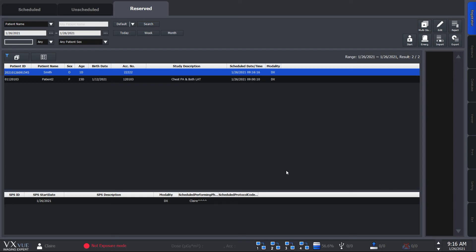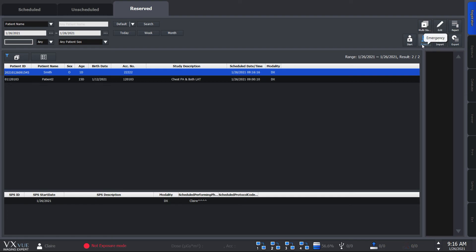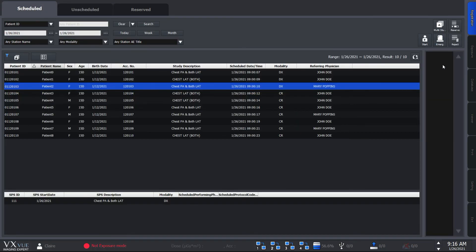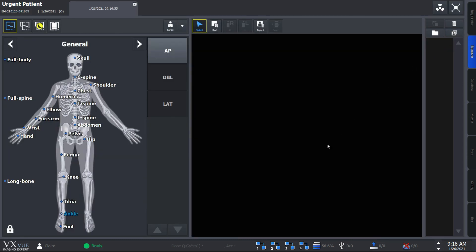Now you may have an emergency where you don't have the time to fill in all these information. And in that case, just hit the emergency button and it'll take you directly to exposure mode. We have the emergency button here under the reserve panel, here on the unscheduled panel, and here on the scheduled panel. You can fill in the patient information for later in the exposure mode.